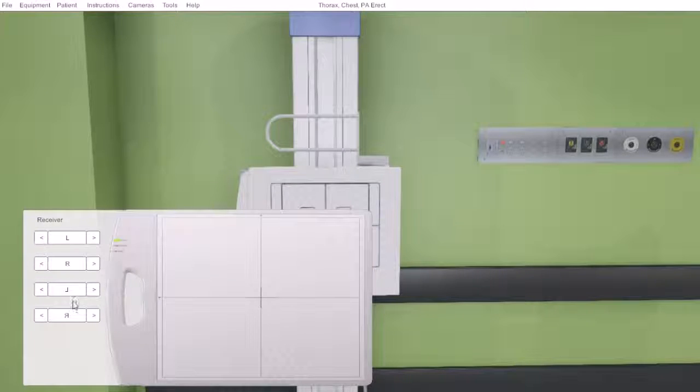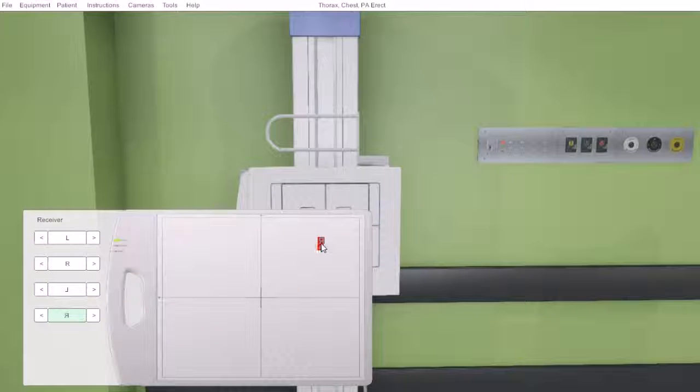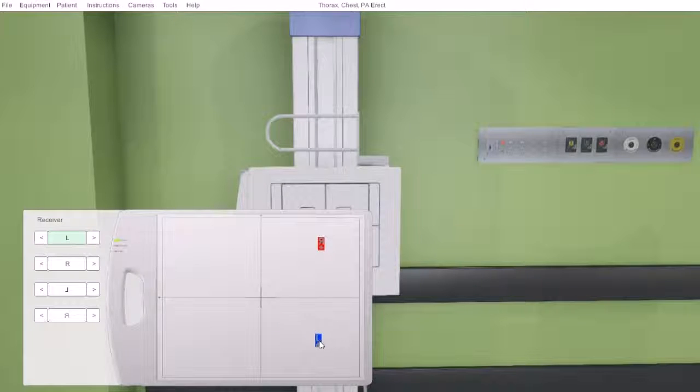And here, like we did with our table receptor, we can place our side markers as we see fit.